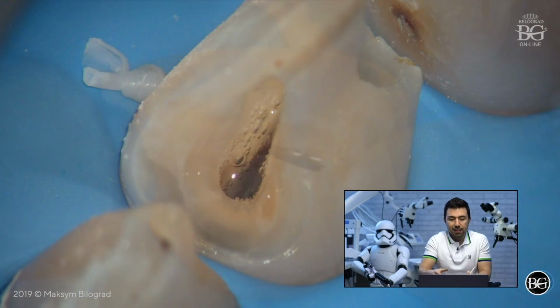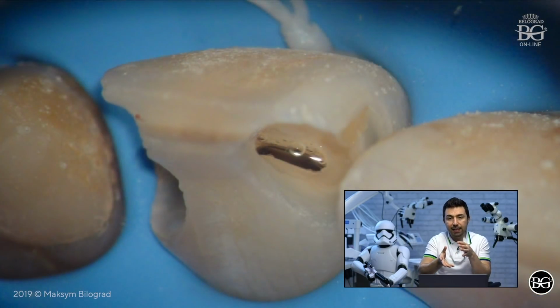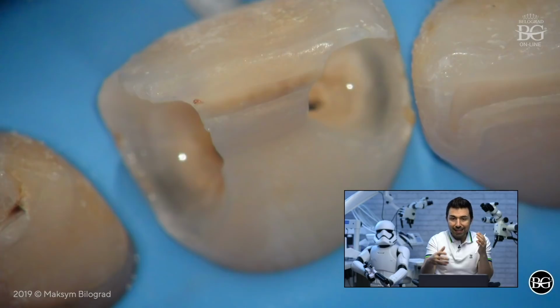So I just slightly increased my access to remove the pulp horns and to be able to irrigate this root canal system efficiently. According to the classic approach to endodontic access, this is absolutely not correct.